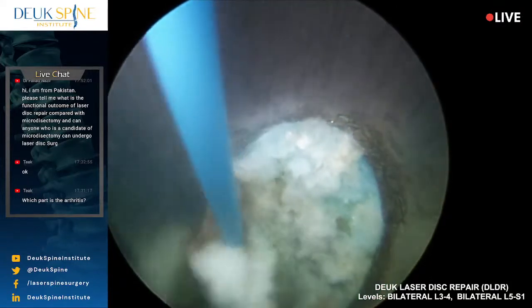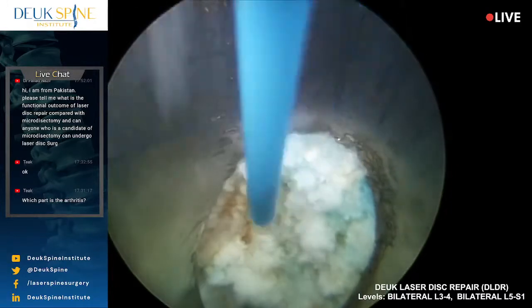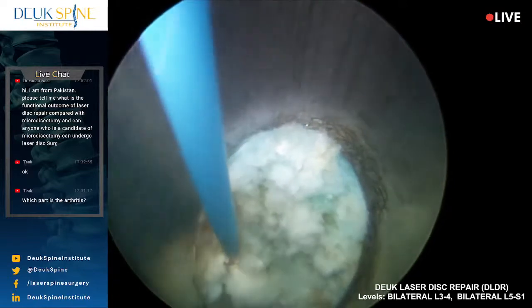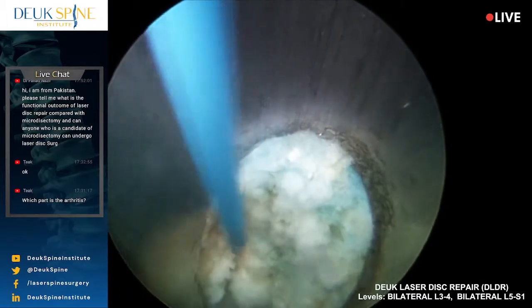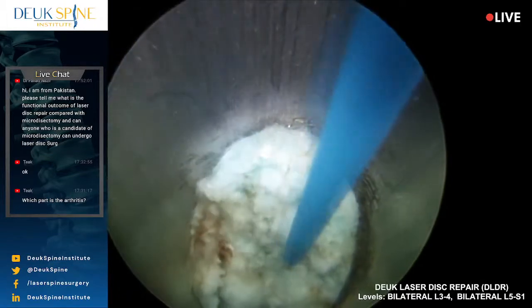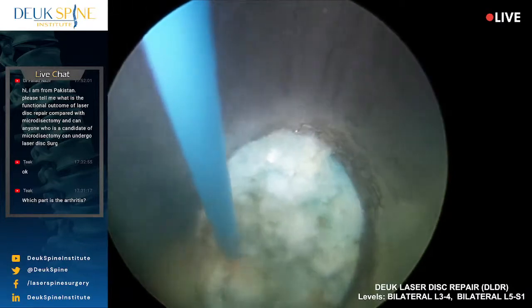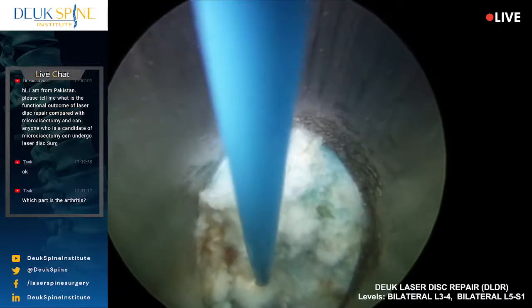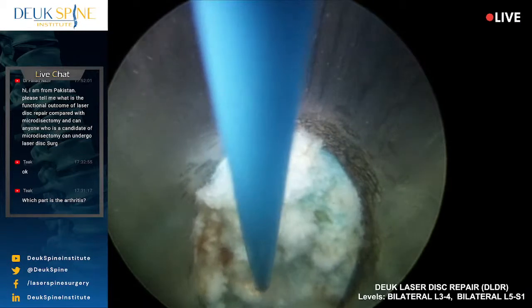Yep, I got it. Any other questions from our audience? Yes, we have a commenter from Pakistan. He says he couldn't hear you. He says, please tell me what is the functional outcome of laser disc repair compared to a microdiscectomy? And can anyone who is a candidate for a microdiscectomy undergo laser surgery?